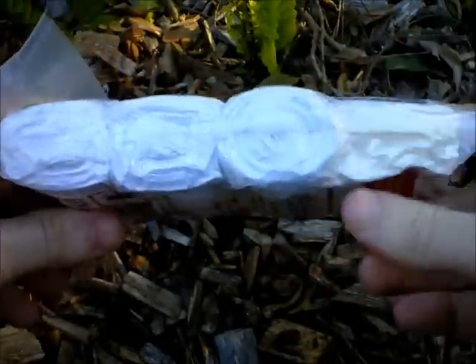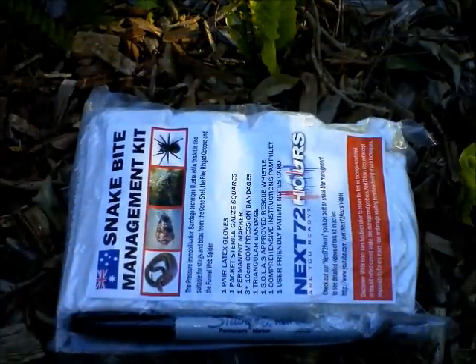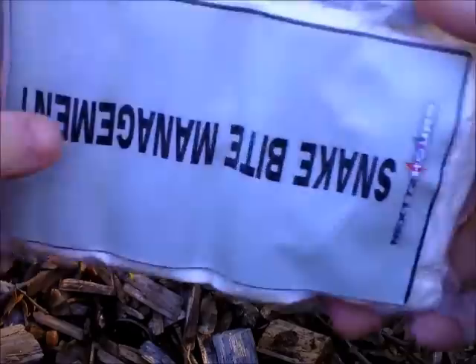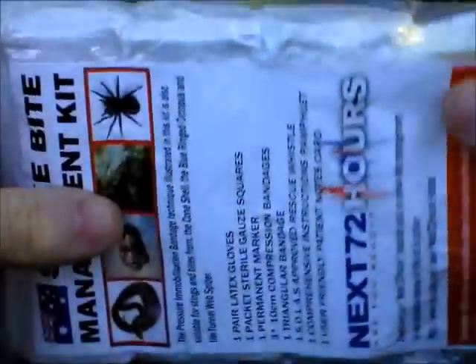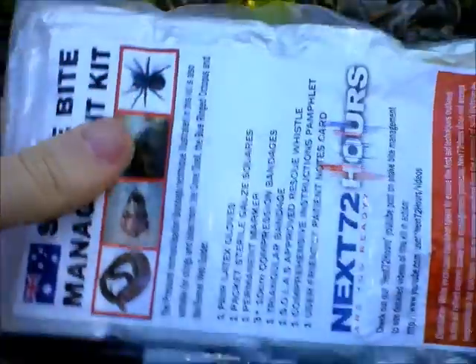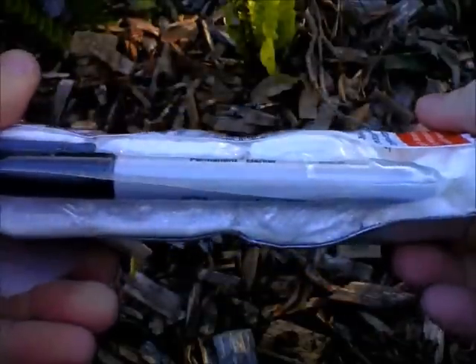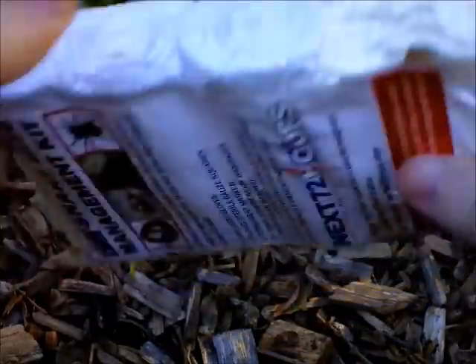One of the major problems with any first aid kit is that you have a small accident, cut yourself, or have a small injury — you go to your first aid kit, pull something out, and later on forget to top it up again. With this, you can take one look and know that it's all still there, it's still vacuum packed, everything listed on the contents is still in the bag. That's vitally important, because when it comes to treating a snake bite you're going to need all of these things. It would be no good if you open this up only to find someone's already borrowed a bandage for a sprain or taken the pen out, and you're at a loss of what to do.